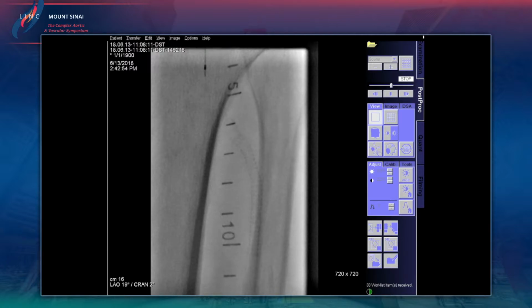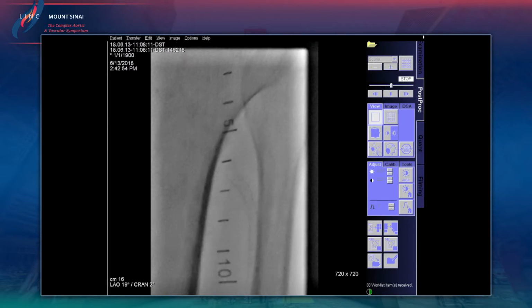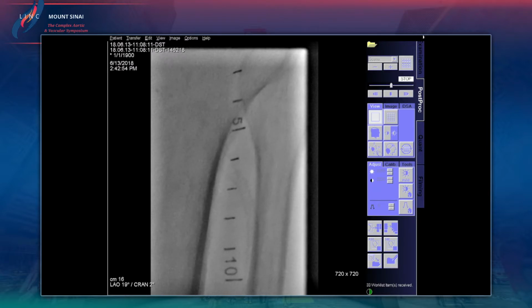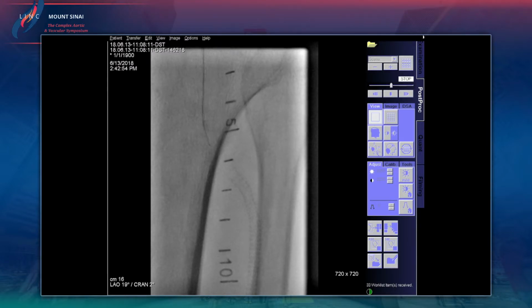Okay. So it's very migratory over here, Marianne, and that's the problem a lot of times. Sahil would tell you, we share a lot of the patients that go here and there. And this is the issue, a lot of times the history that we get here is very different. So the takeoff is a little odd here. I'm just going to make a better curve on my wire. I think the problem with the Command at times is the curve tends to fall off. So let me see. I'm going to need a better curve.